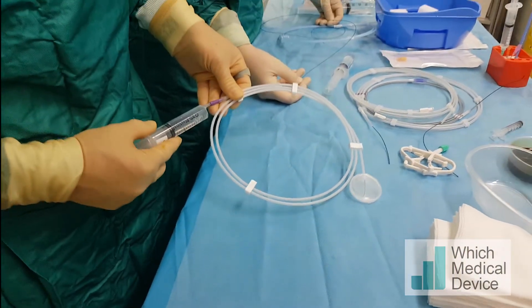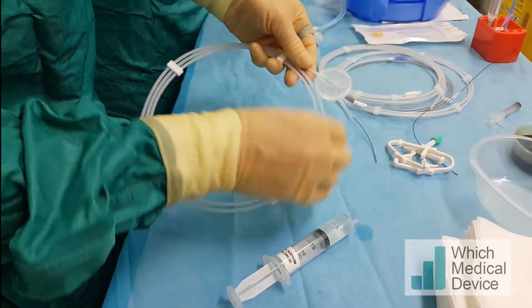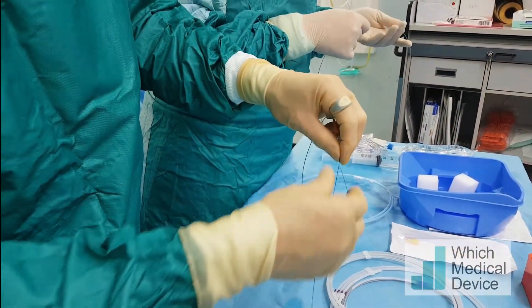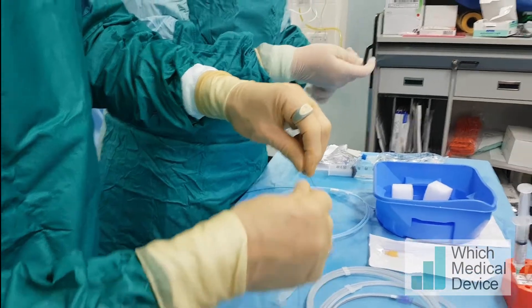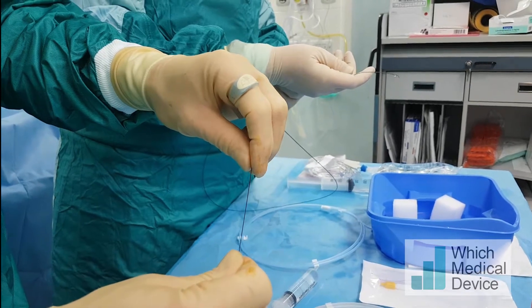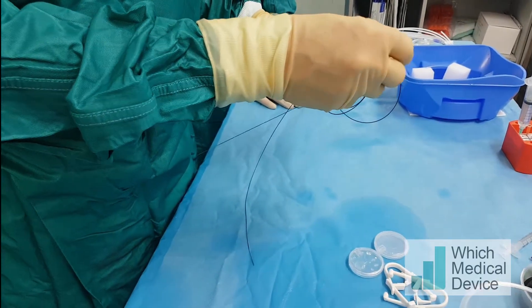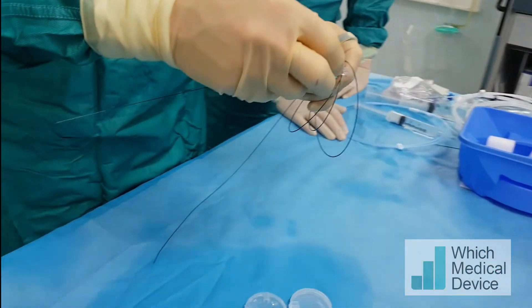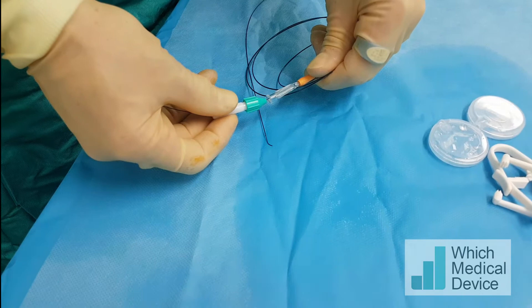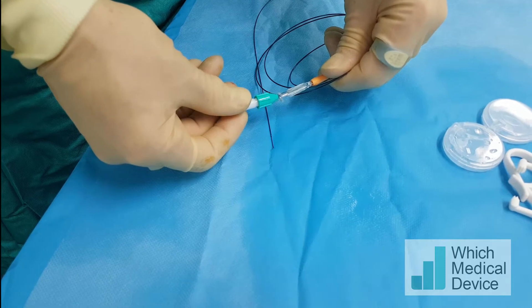I'm going to flush the guide wire first, then back-load it into a 2 French pro-grade microcatheter, feeding it through the back end and taking it right to the tip. Now we're putting the torque device on. You can see the wire has gone through several loops with the catheter. I'm going to protrude it out at the end and check the torque ability — rotating the torque device shows essentially one-to-one torque, which is excellent.